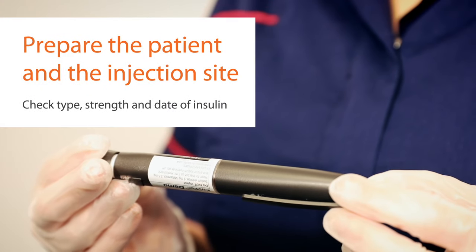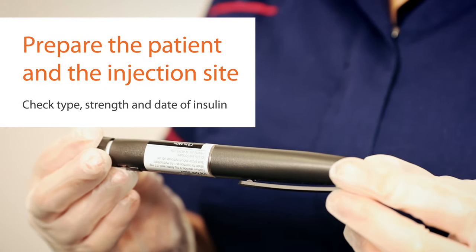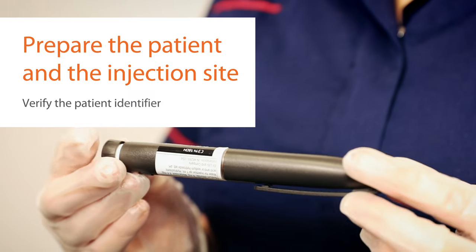First, confirm that you have the correct type of insulin and check its expiry date, then verify the patient's identity.